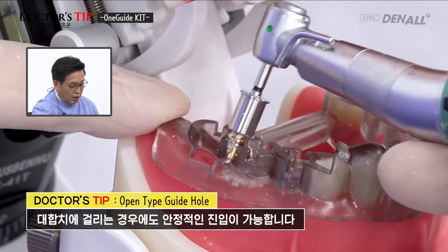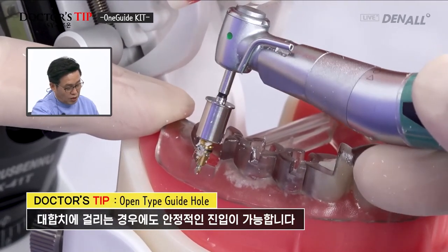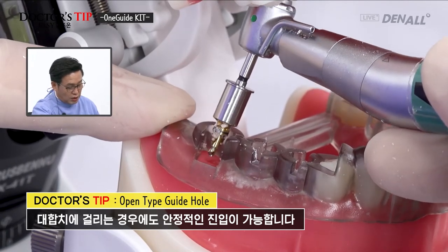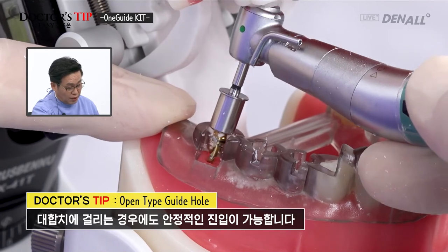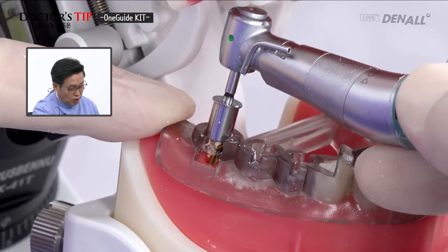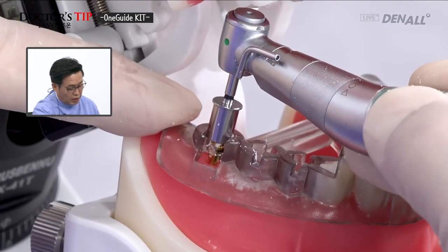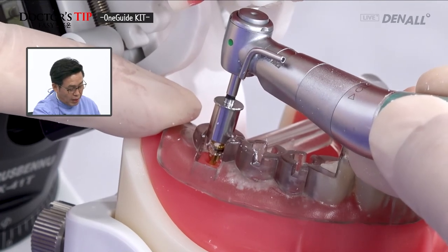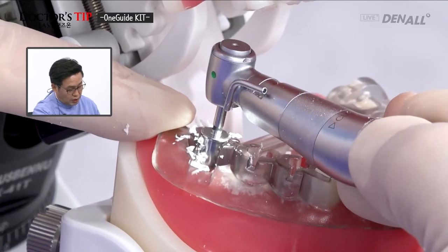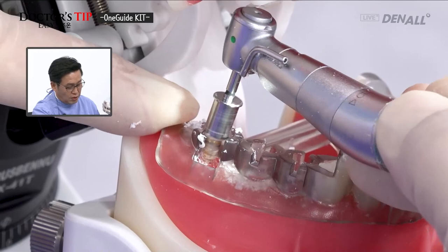The drill hole is open type, and as shown, even if it hits the opposing arch, you can go in like this. Even if inter-arch distance is narrow, it is accessible. This is open hole type, so on the lingual, when it is not open, you are going to put the barrel there and hold it stably to do the drilling. So up and down motion is going to be done. So you're going to go in full length for initial drilling.